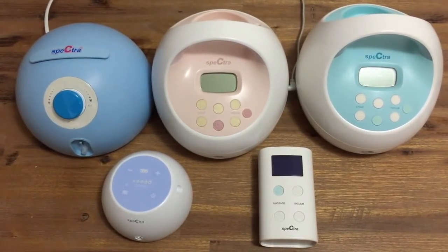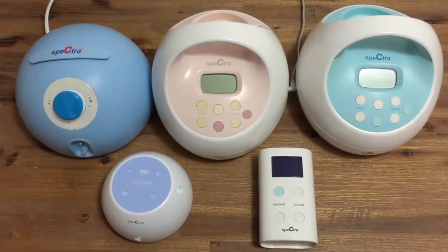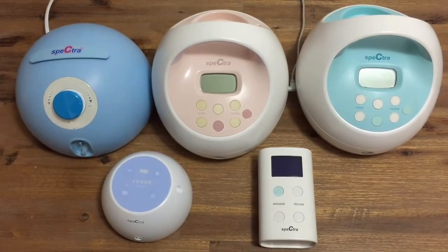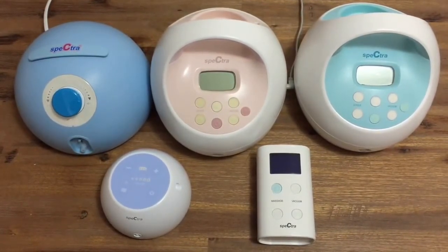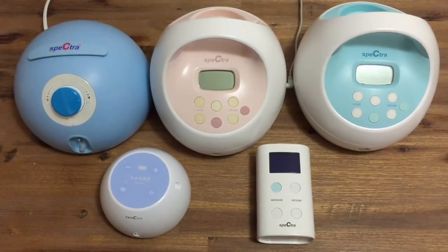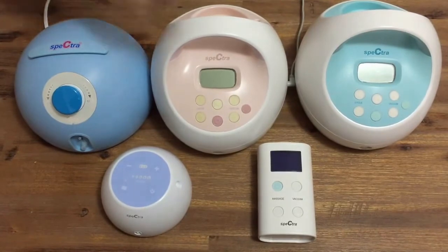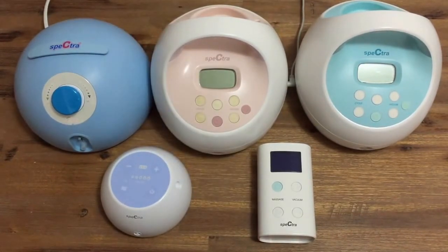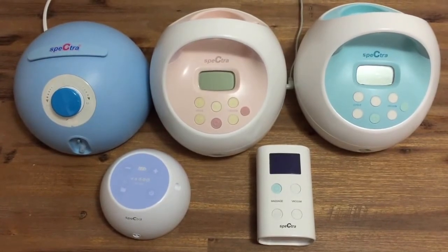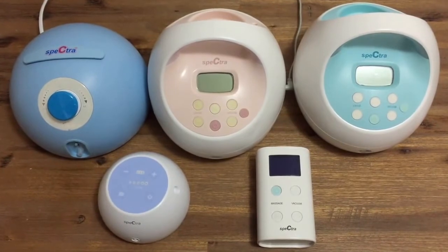The Spectra M1 is a personal use breast pump. It's very compact and perfect for throwing in your nappy bag. The M1 has five vacuum levels plus the let down mode, and the cycle speed on the M1 will slow as the vacuum strength increases. The Spectra 9+ also varies cycle speed as you change the suction strength, but it has 10 different suction levels. The 9+ also has an LCD screen and timer function.